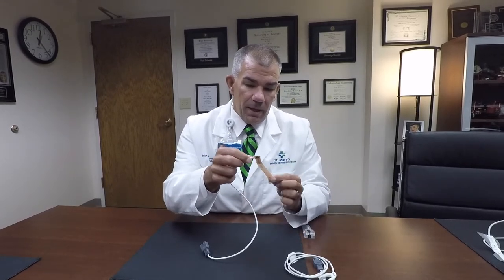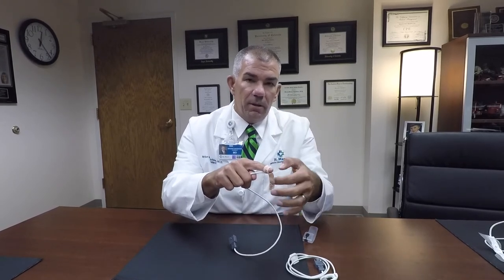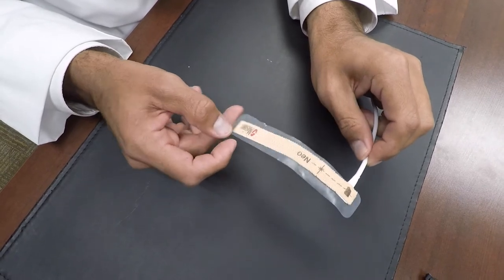Another sensor that you're used to seeing is this one here. This is for patients that are three kilograms and under, or 40 kilograms and over. A lot of the pediatric population will utilize this, although adults can use it as well. You'll see that there are two electronic-looking dots. The sensor is the one that is near the cable, and you want to put that under the pad of the finger. The second one goes over the top of the finger, then wrap it around. The sensor in this spot should be right in alignment with each other, perpendicular through the finger. That's the correct placement for that one.